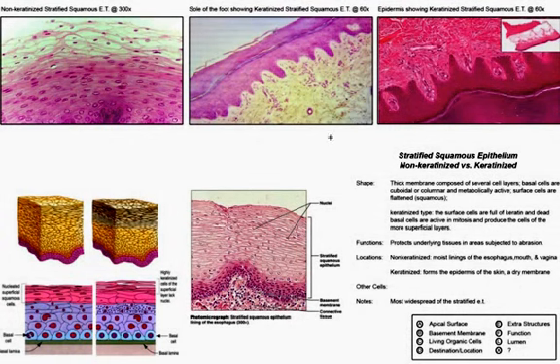In this picture we can see both keratinizing and non-keratinizing stratified squamous epithelial tissue that's going to either line moist body surfaces, most moist body openings like this tissue would, versus the layering of dead cells, the keratinized stratified squamous, that would sit on the surface of our skin that covers our entire body in the integumentary system.